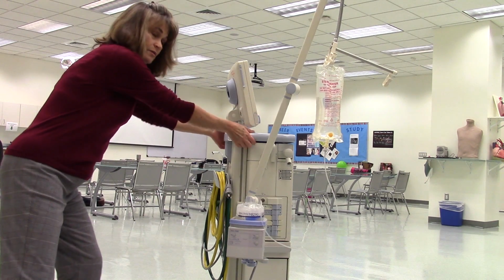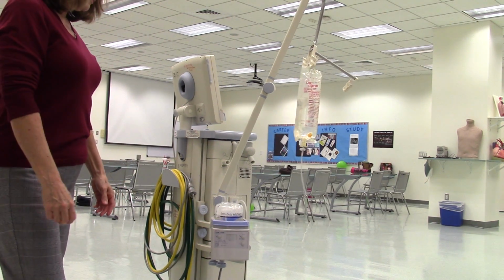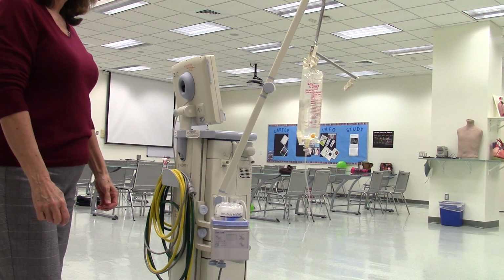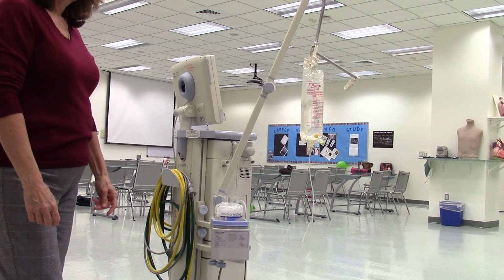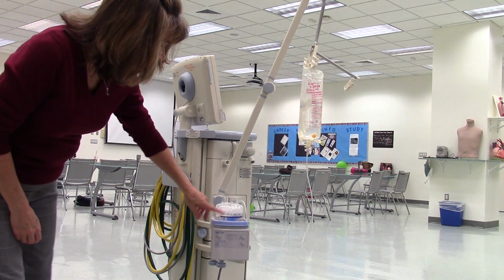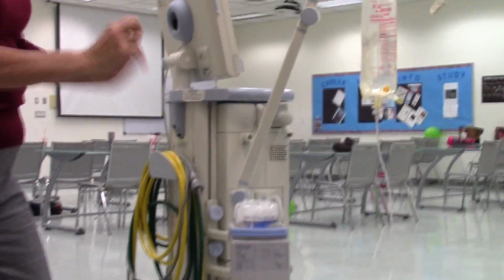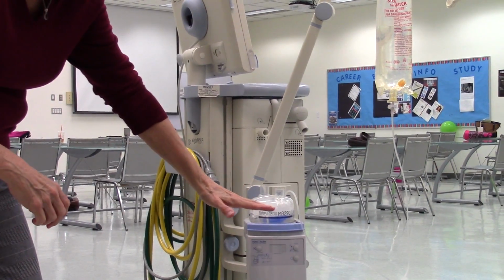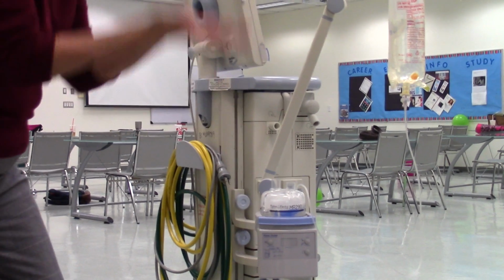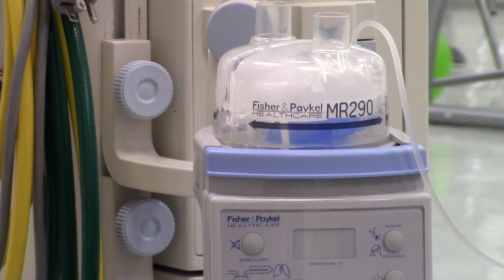When you look inside the water chamber, you will see a blue float and a white float. The blue float controls the H2O level, and the white float is a backup float in case the blue float malfunctions. All right, so let's stop and take a look inside. So there's two floats in there to stop the water. Once the water reaches a certain level, it just covers the bottom, it'll push the blue float up, and that'll stop the water from dripping in. But if it ever breaks, then there's a white float in there as a backup.